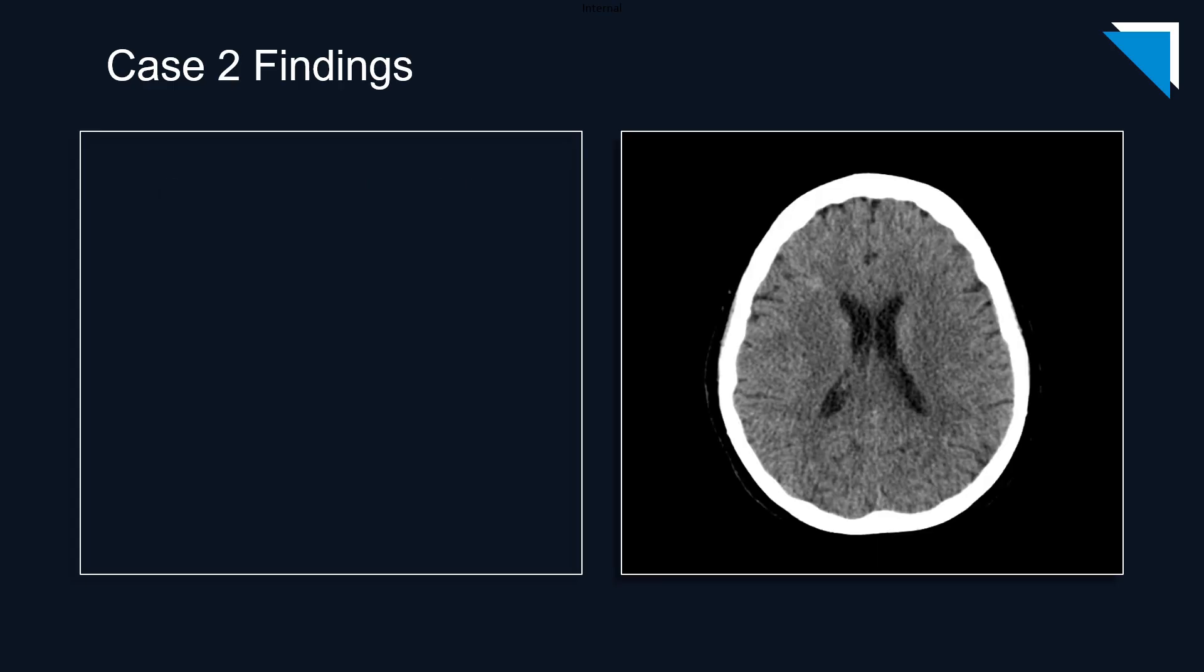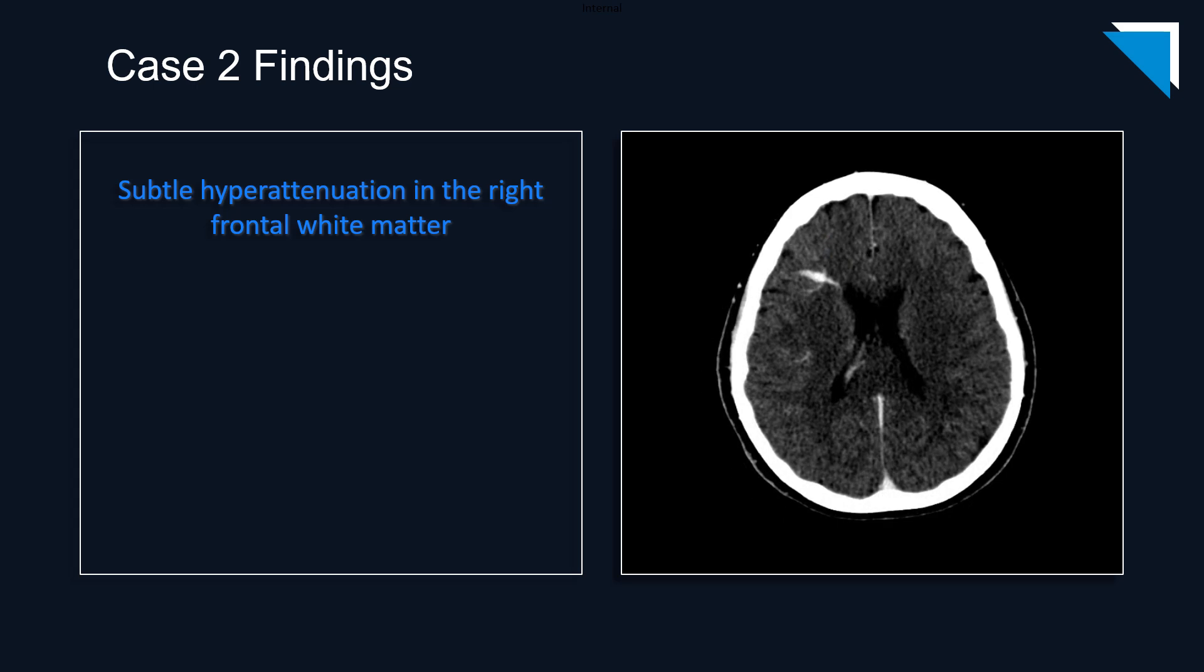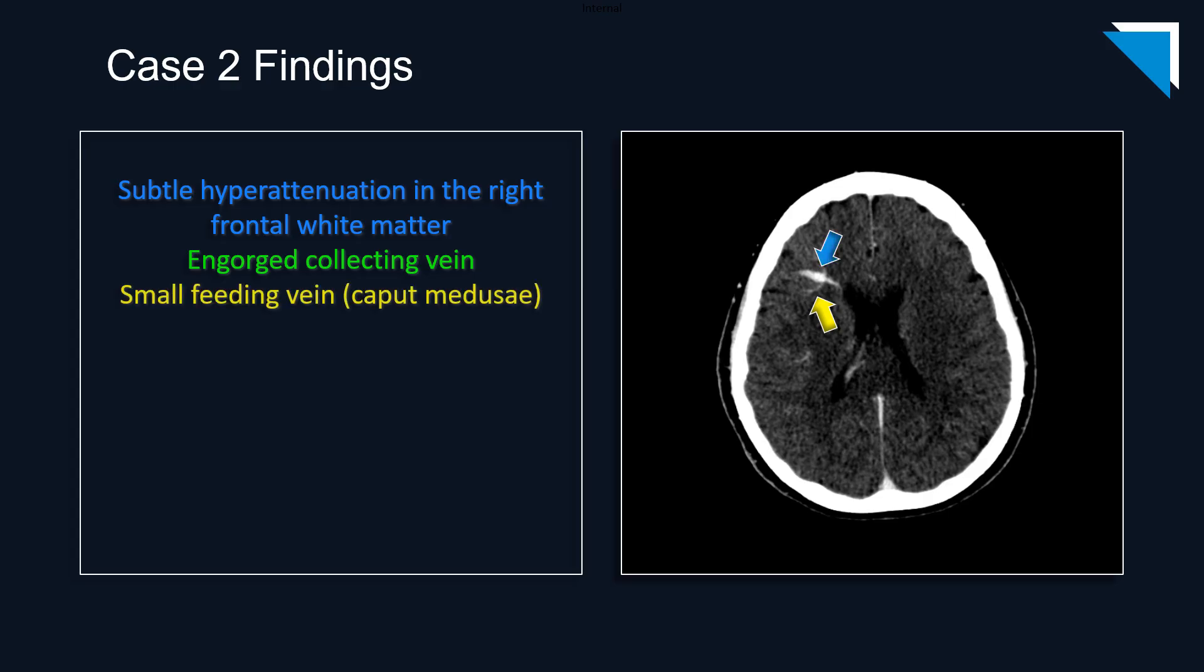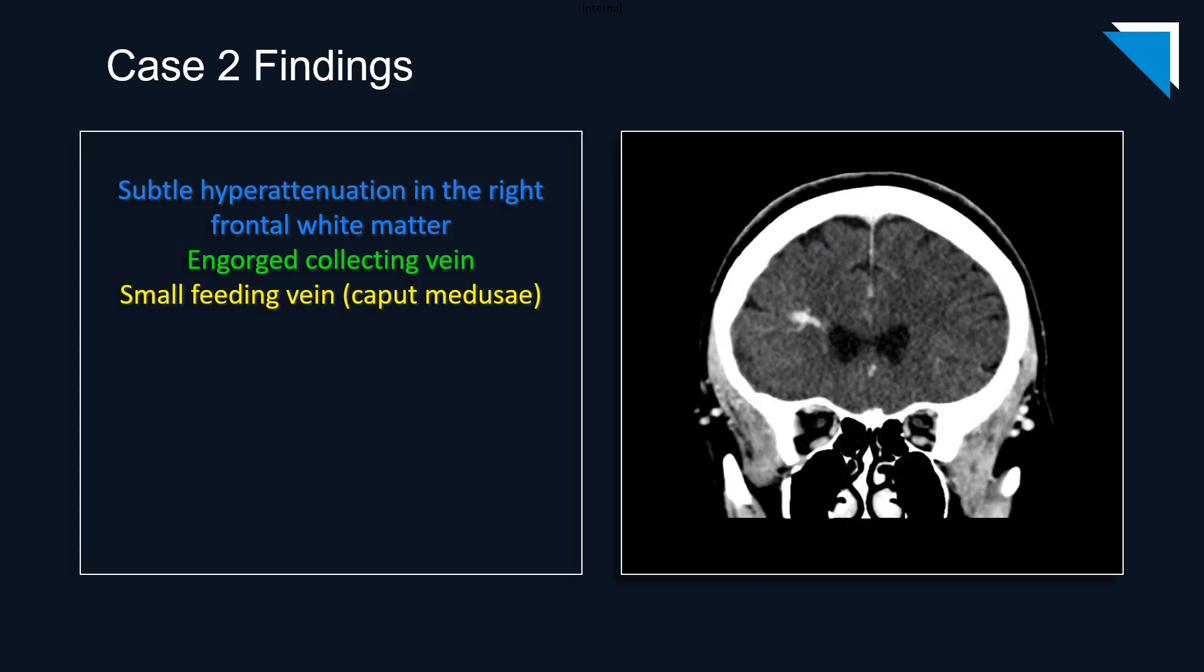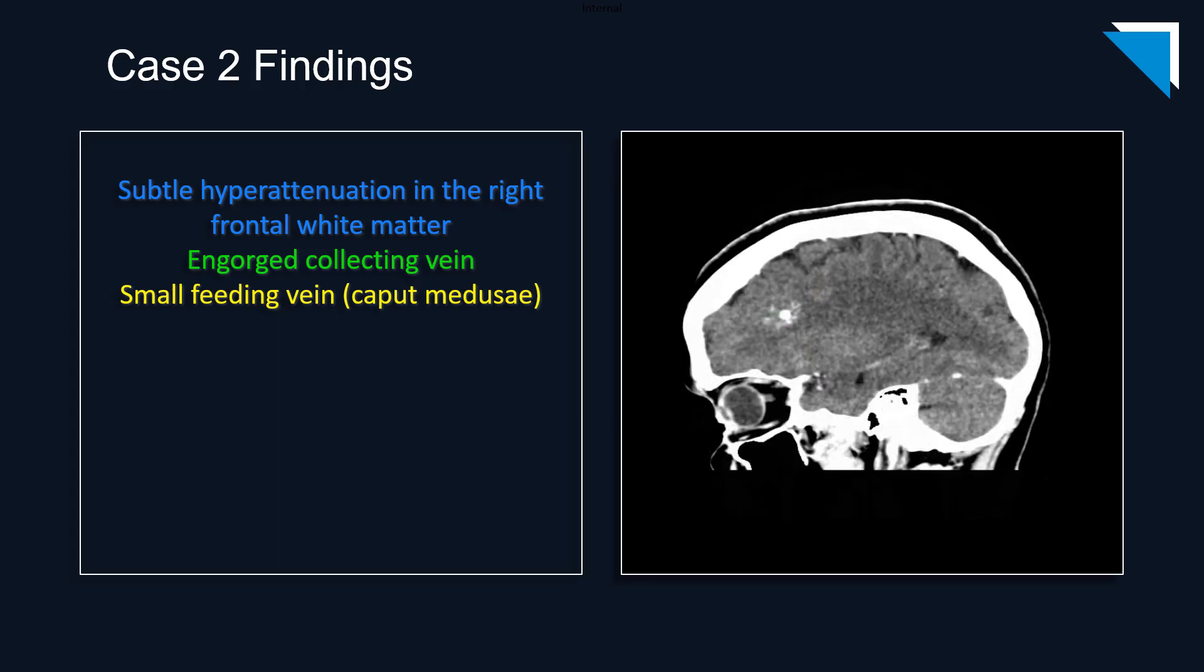Returning to one of the non-contrast axial images, there is faint hyperattenuation in the right frontal white matter. On the corresponding post-contrast arterial phase axial image, there is an engorged collecting vein with multiple small feeding veins known as caput medusae. Moving on to this coronal image, we can again see the engorged collecting vein with multiple small feeding veins. On this sagittal image, we're catching the engorged collecting vein on face with multiple small surrounding tributaries.